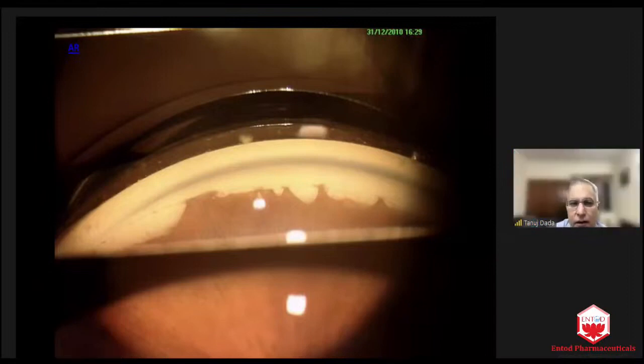Very different pathology. These are developmental anomalies of the anterior chamber angle. If you see carefully, you have this prominent band-like anterior displaced Schwalbe's line and the iris is going and attaching to it. So this pulls the iris and causes corectopia, and gonioscopy is diagnostic: very anterior insertion of the iris to the broad ciliary body band. So this is typical of Axenfeld-Rieger anomaly, okay, and you will normally see this bilateral.